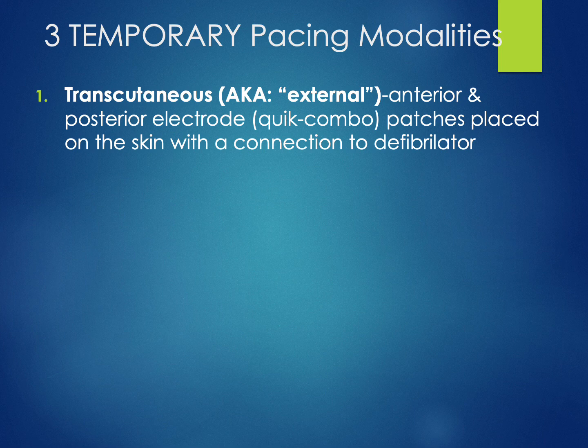Well, there are actually a few different kinds of devices we can use to pace a patient's heart. The key difference to be aware of is when each would be most appropriate, and also the risks that are posed with each way we pace a patient. So here we're going to discuss the temporary pacing modalities. This is not a long-term solution, and it actually requires a power source outside the body.